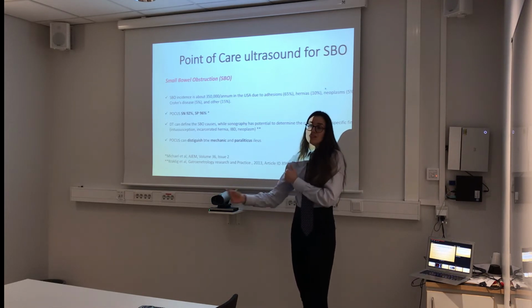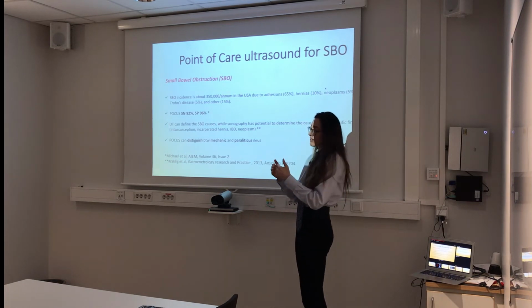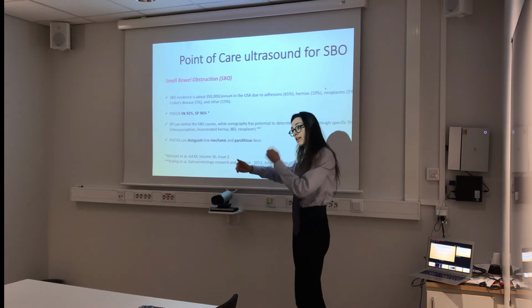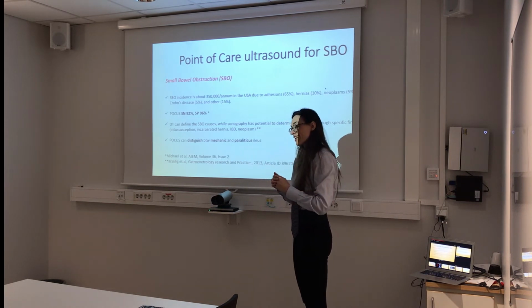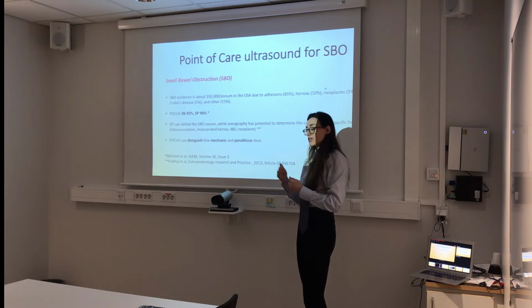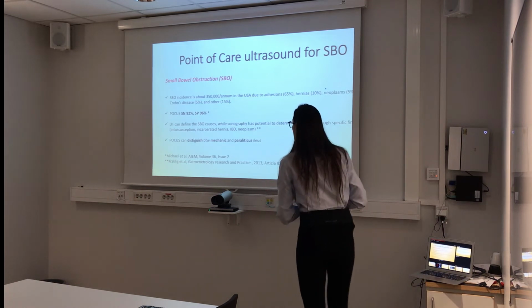One diagnosis doesn't rule out the other one, but this helps you a lot in thinking about decision making and the ongoing plan for the patient, okay? As I always stress, ultrasound is not the answer for the patient plan, but it can help you a lot in the decision making, okay?